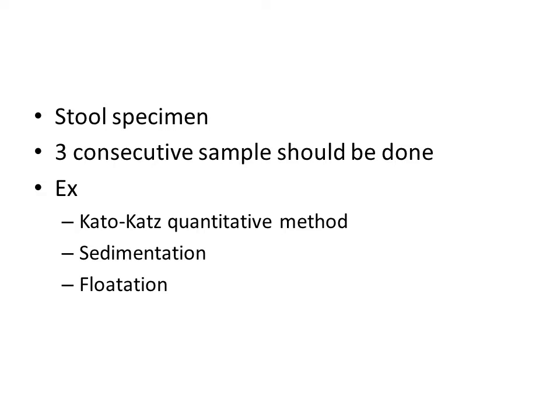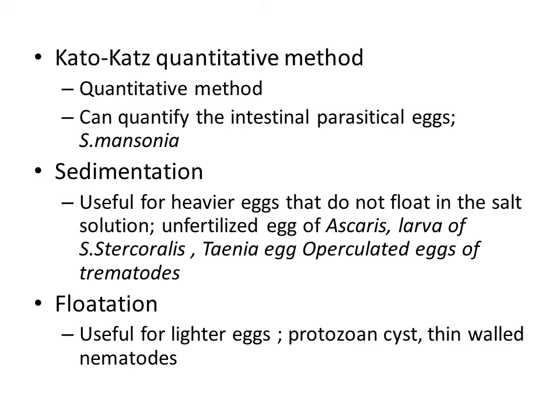When we consider the stool sample, the concentration techniques most commonly used are Kato-Katz quantitative method, sedimentation method, and flotation method. Now we will go one by one.